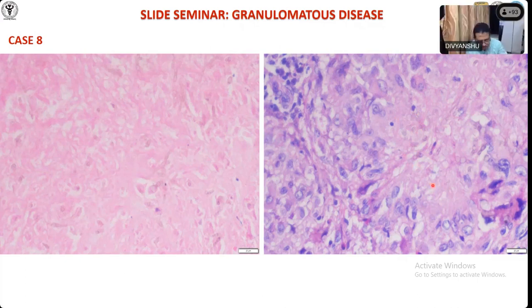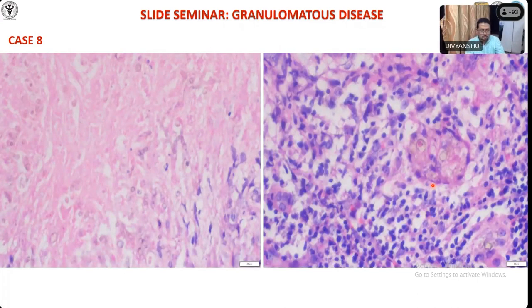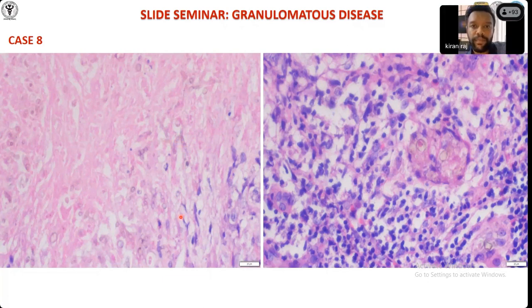There's another slide. Next, see this? Can you see this? Sir, budding is present, with broad base. Acute angle branching is present. Right? Budding is present, branching is present. And what is this?